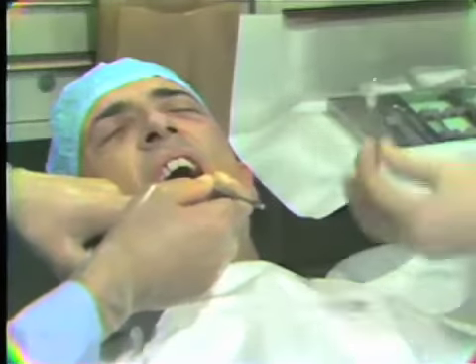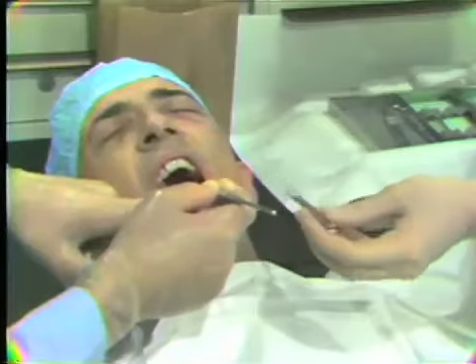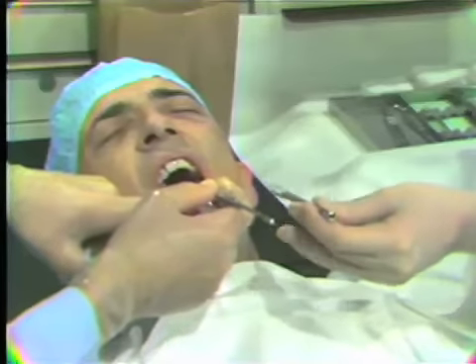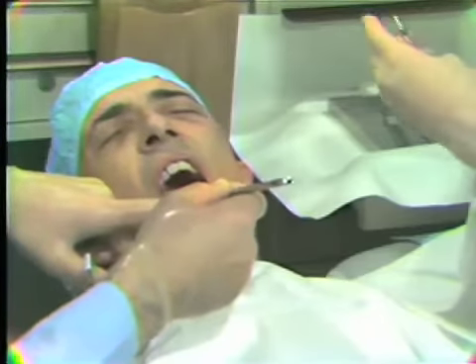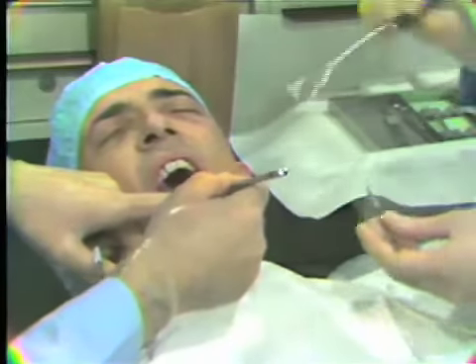And you note as she moves in with the probe, I hold the instrument directly in front of the patient's mouth, hardly removing it from the surgical site, as she comes in parallel to the instrument that I am about to give up, and we make the transfer smoothly and are able to go right back to the surgical site to explore or use the instrument as necessary.